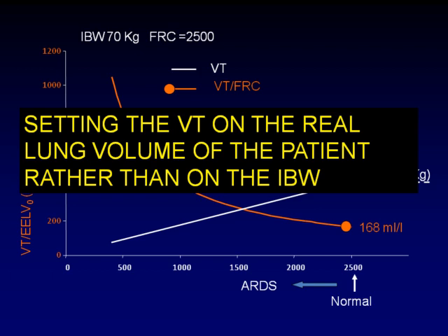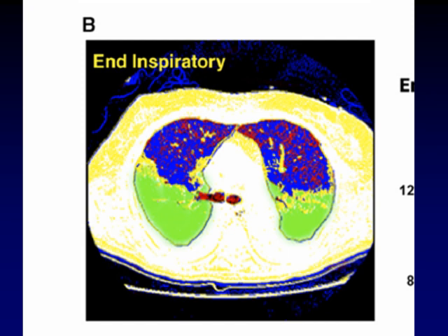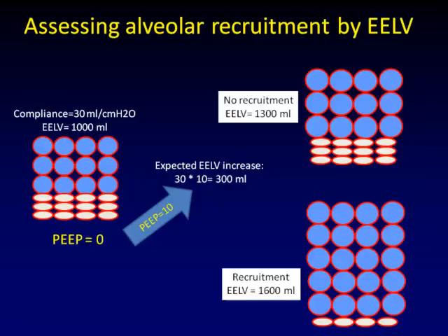Once again, going back to the fact that even with lung protective ventilation, we might have overstretching, because body weight, also predicted body weight, is not a very good indicator of the size of the lung in the first place, and moreover, of the size of the available lung. So ideal body weight is a very crude measurement. It's very good. It works 70% of the time. We should follow the rule, but keep in mind that we should check something else too.